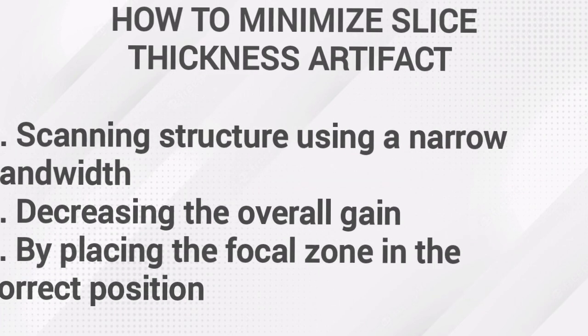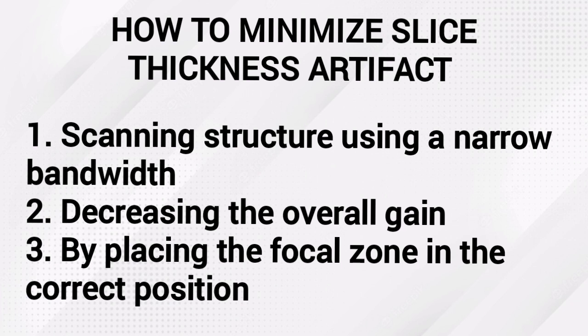Now, slice thickness artifacts can be minimized by, number 1, scanning the structure using a narrow bandwidth. Number 2, decreasing the overall gain. And number 3, by placing the focal zone in the correct position.